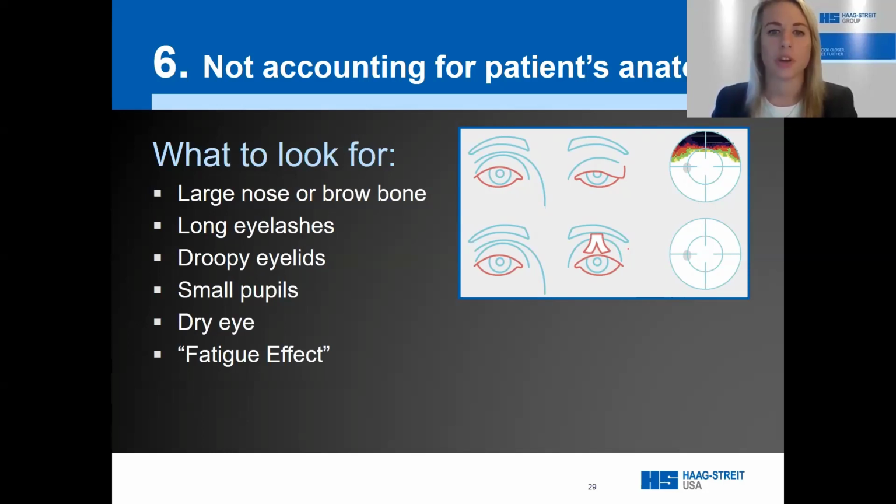Something else to watch out for is if your patient has dry eyes. For anybody that has experienced dryness, we know that it can blur our vision and change upon each blink. This is why it is important for us as technicians to encourage patients to blink throughout the visual field. Thankfully, your Octopus perimeter knows each time a patient blinks and will represent that same stimulus later on in the visual field, so no data is lost.